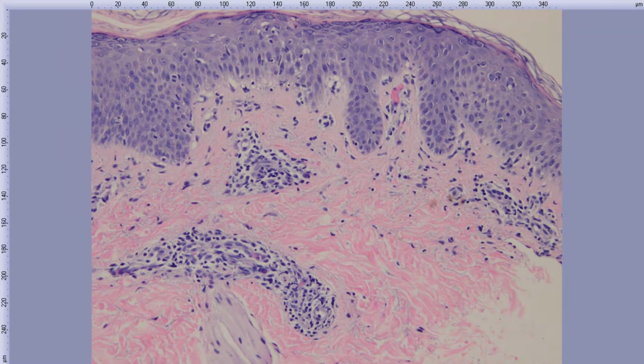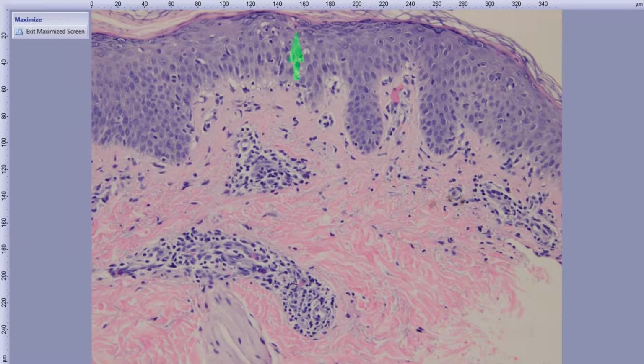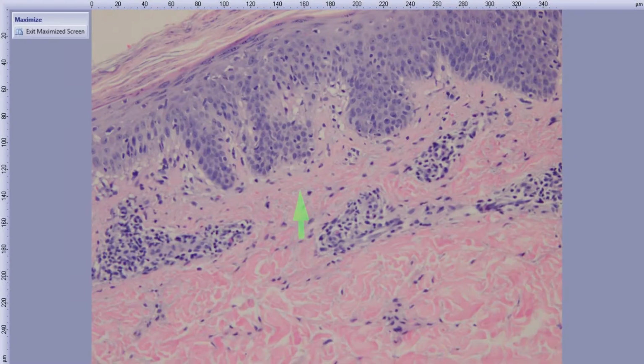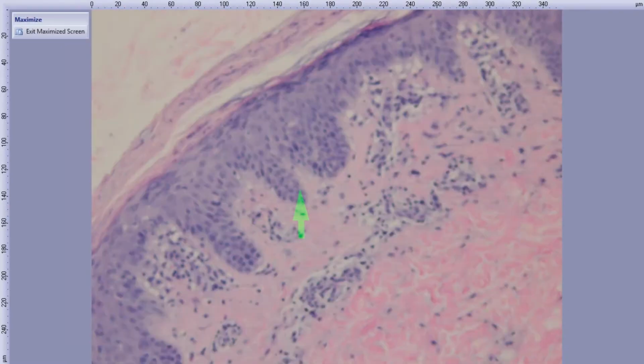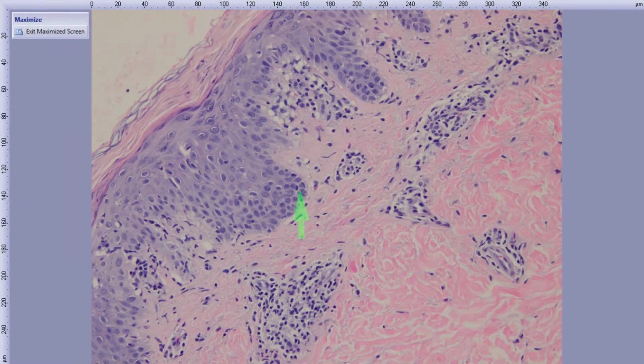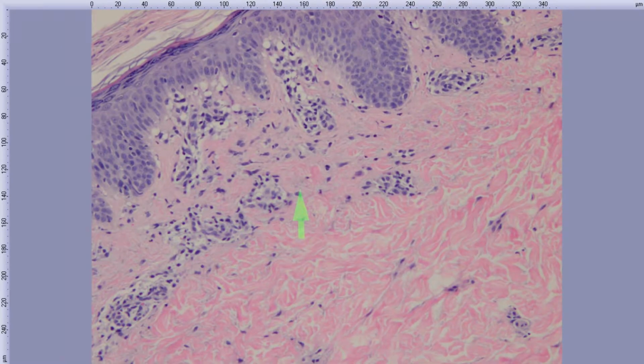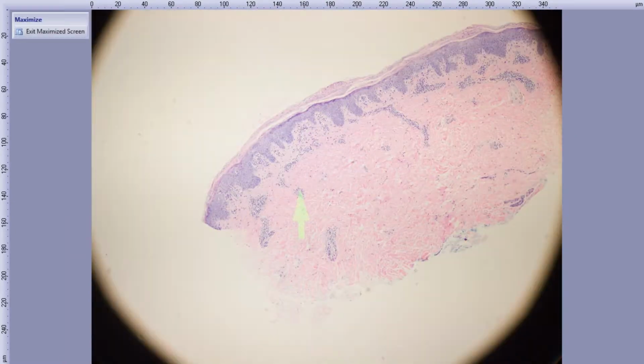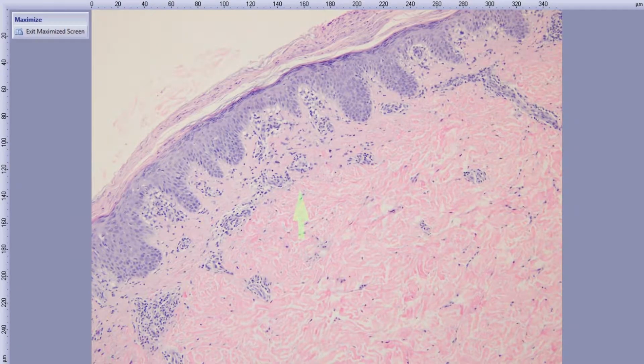There's a little rare necrotic keratinocyte, but not a ton of them. And then this superficial lymphocytic infiltrate. And if I had the perfect case, I would like to have a few maybe extravasated reds. So this was actually a case, and we also knew the clinical on this one, which is important to know, but this was Pityriasis lichenoides chronica, PLC.